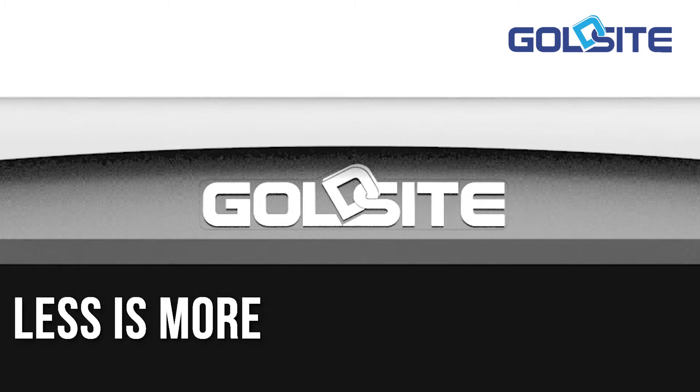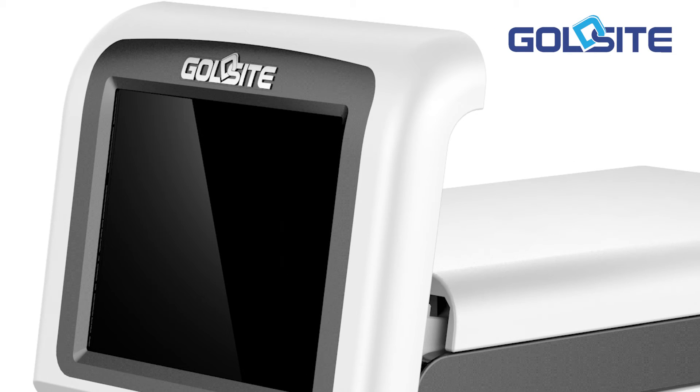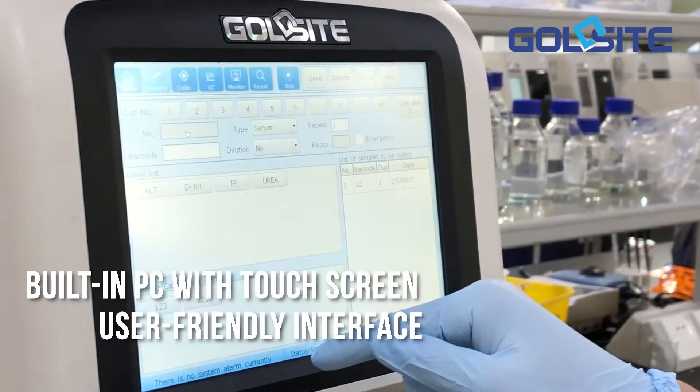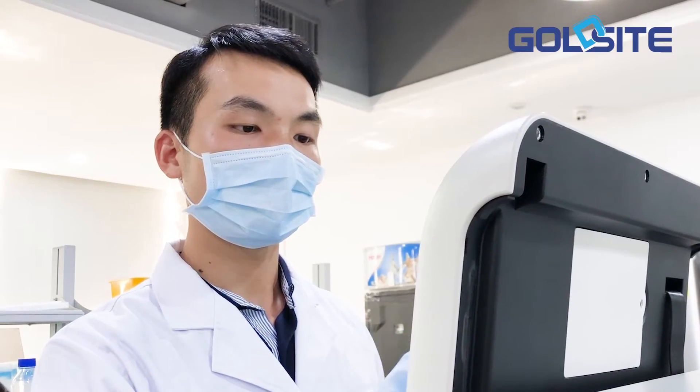Less is more. Its simple and plain appearance is perfectly matched to a minimalism design philosophy. Built-in PC with touchscreen and user-friendly interface offer you a better operation experience.